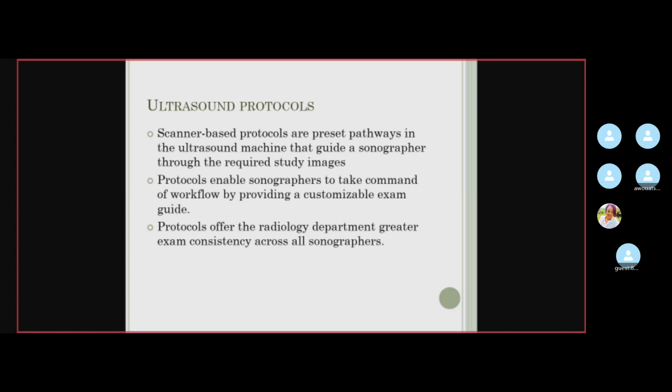If you are doing an abdominal study, you first enter the details of the patient, and then you select the protocol, abdomen. Whenever we select that protocol, all the parameters are already adjusted for the abdomen. So which probe will abdomen use?